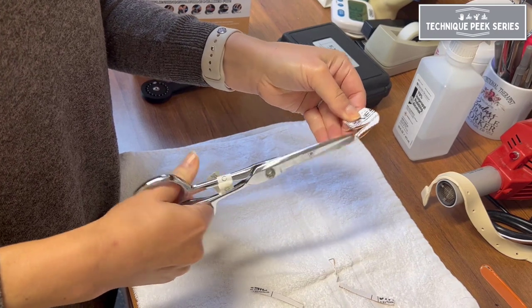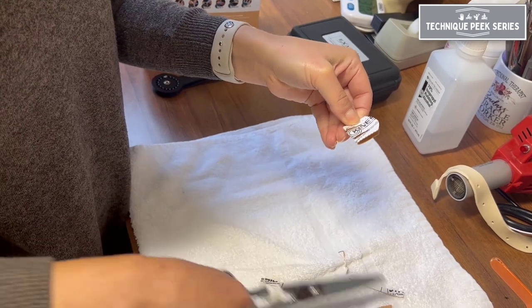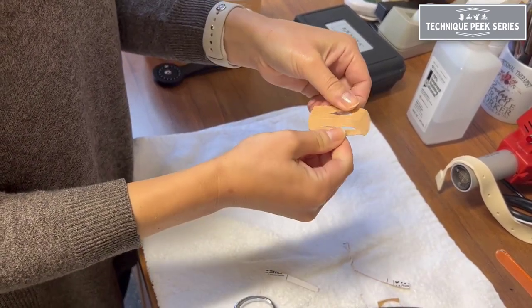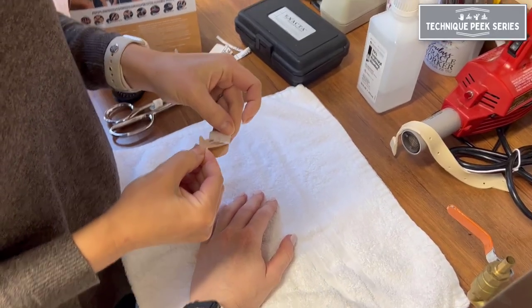The more pieces you cut, the more surface area you will cover and therefore the greater effectiveness your technique will have. Here I have cut four strips, which I will fan out over the dorsal aspect of the PIP joint upon application.